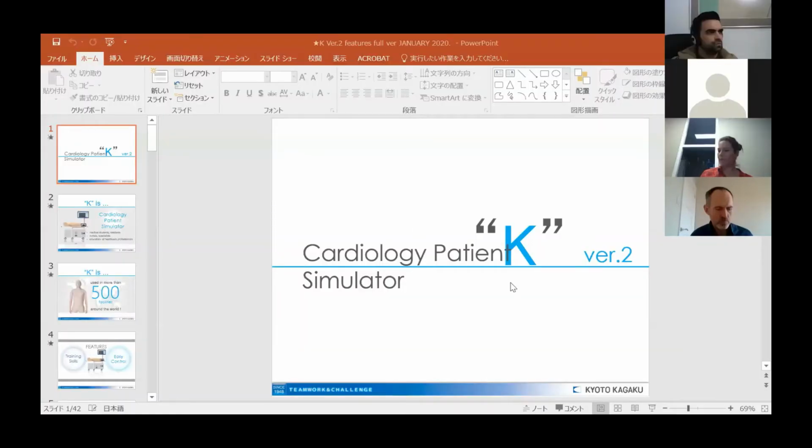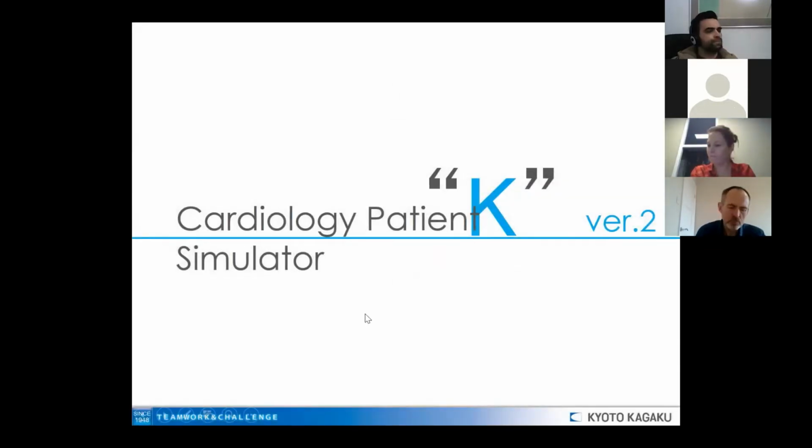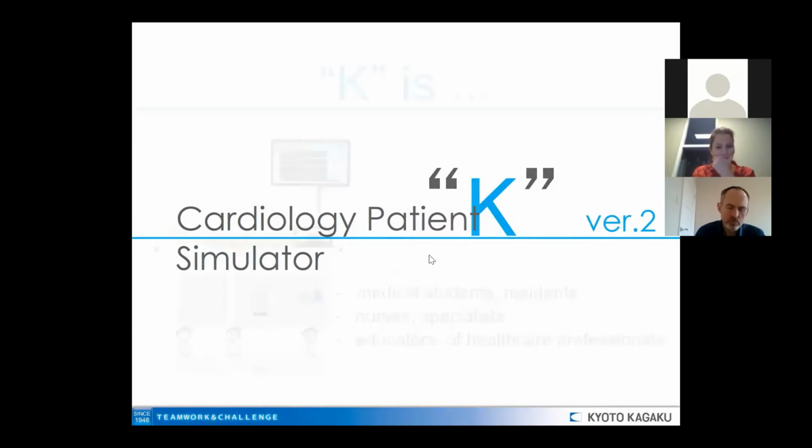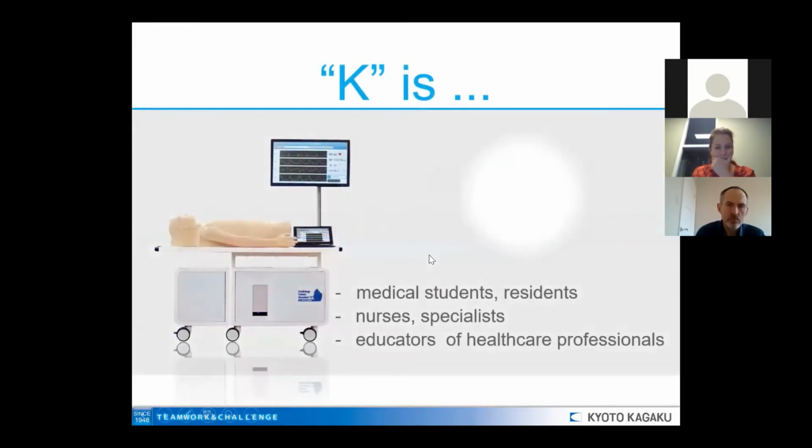We're gonna start with the cardiology patient K. Okay. And well, this is the version 2, because a long time ago there was the very first model we developed for cardiology examination, but this is the second version that is being promoted.